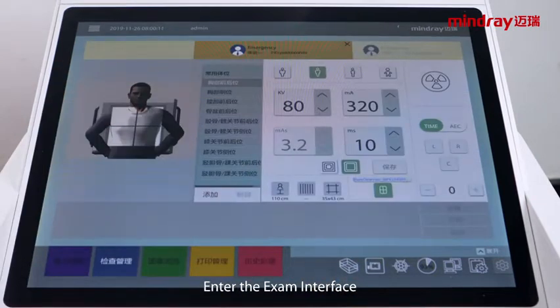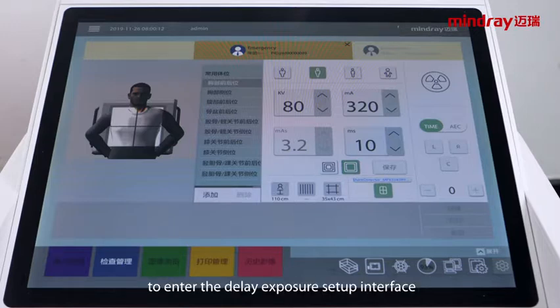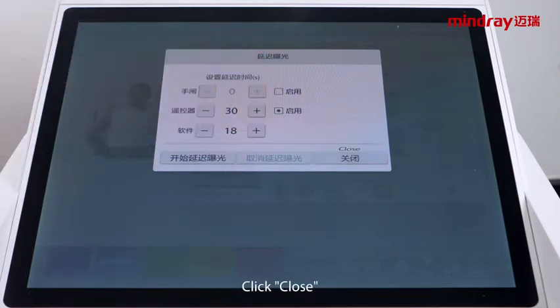Enter the exam interface. Click the radiation icon in the upper right corner to enter the delayed exposure setup interface. Cancel the delayed exposure function of the hand switch. Click close.